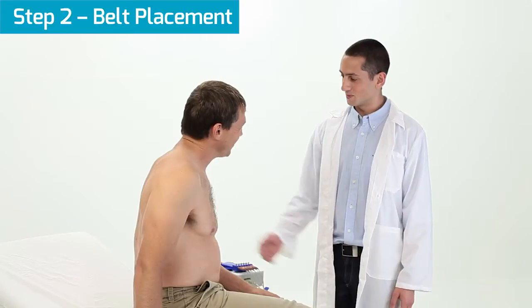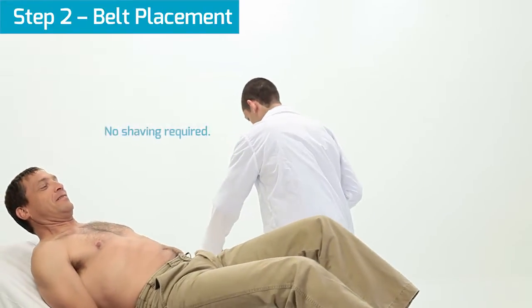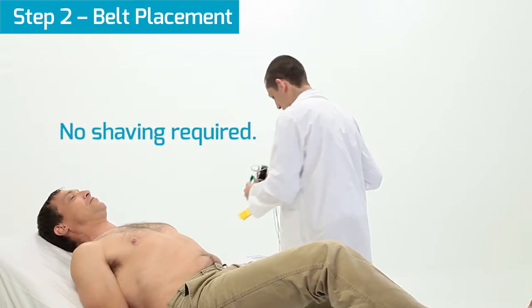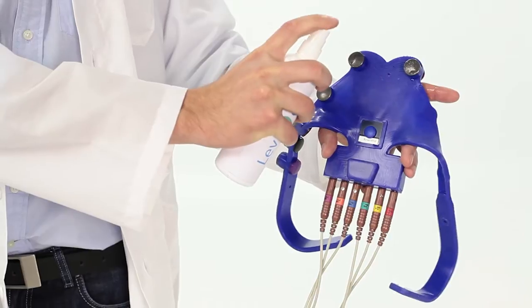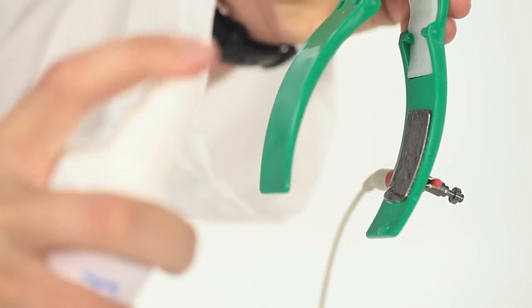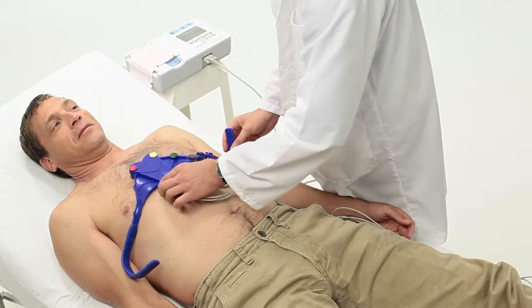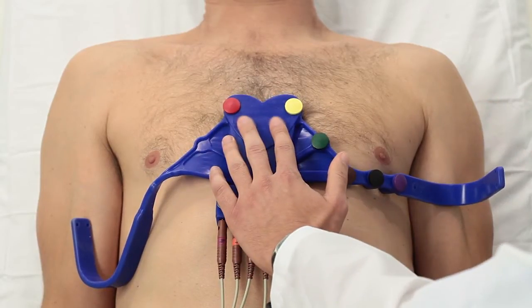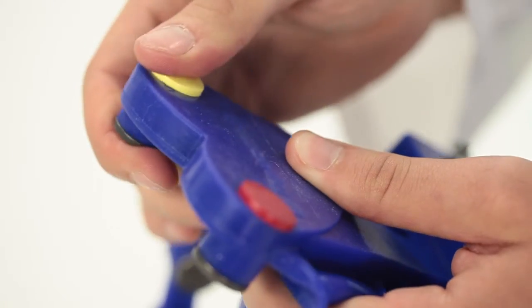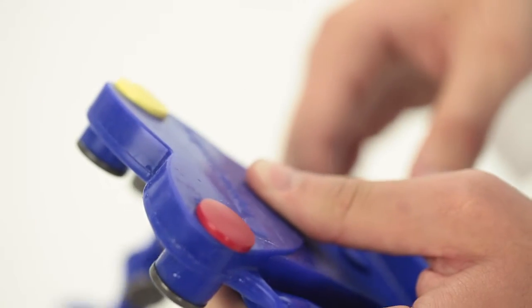For the second step, ensure the patient is lying comfortably on a flat surface. Note that there is no need to shave the patient. Wet the electrodes with the LevMed electrode conductive spray. Place the ECG belt on the patient's chest with V1 and V2 symmetrically on both sides of the sternum. If needed, V1 and V2 may be slightly bent to ensure good contact is achieved.